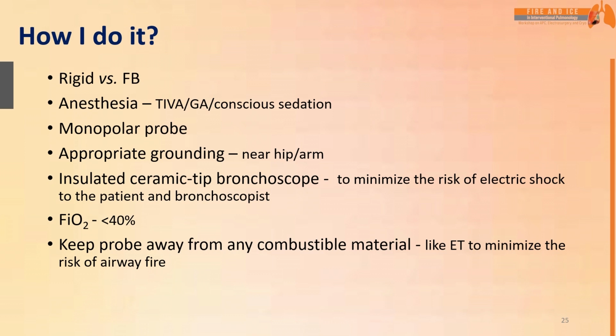probe. One asked about the question of airway firing. Yes, we can minimize airway firing if we keep the FiO2 below 40%, and always keep the probe away from any combustible material like the endotracheal tube.